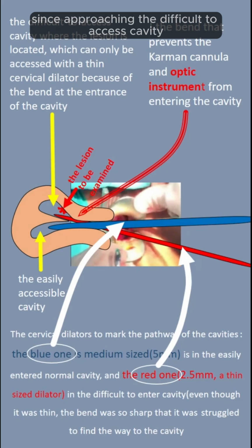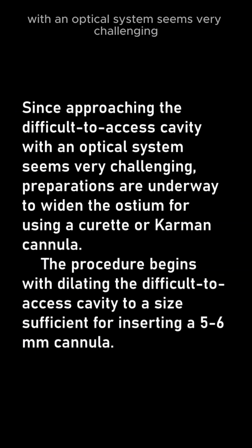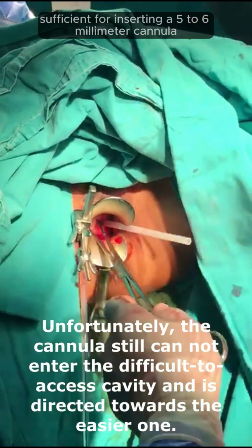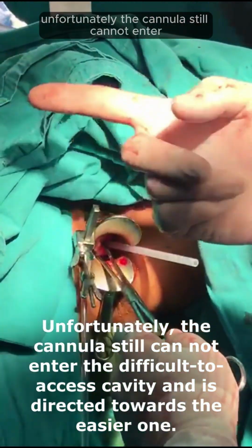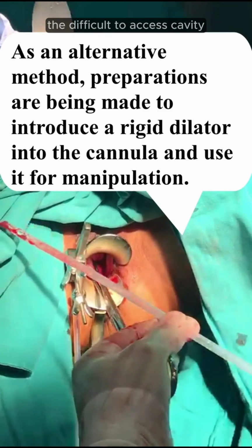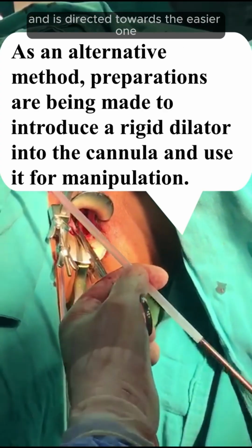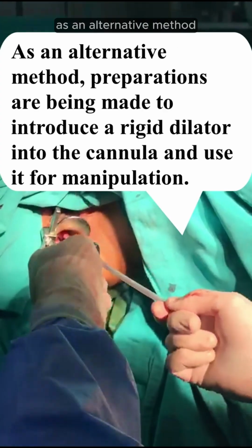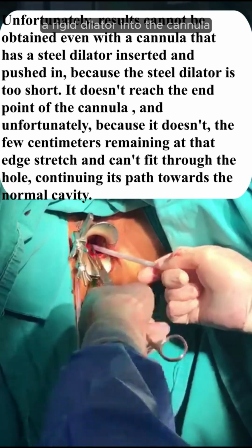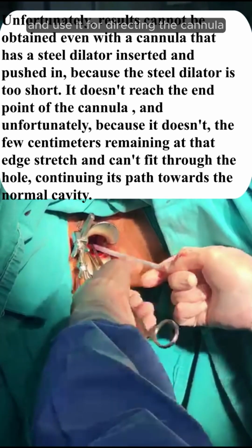Since approaching the difficult to access cavity with an optical system seems very challenging, preparations are underway to widen the ostium for using a curette or Karman cannula. The procedure begins with dilating the difficult to access cavity to a size sufficient for inserting a 5 to 6 mm cannula. Unfortunately, the cannula still cannot enter the difficult to access cavity, which contains the lesion and is directed towards the easier one. As an alternative method, preparations are being made to introduce a rigid dilator into the cannula and use it for directing the cannula.